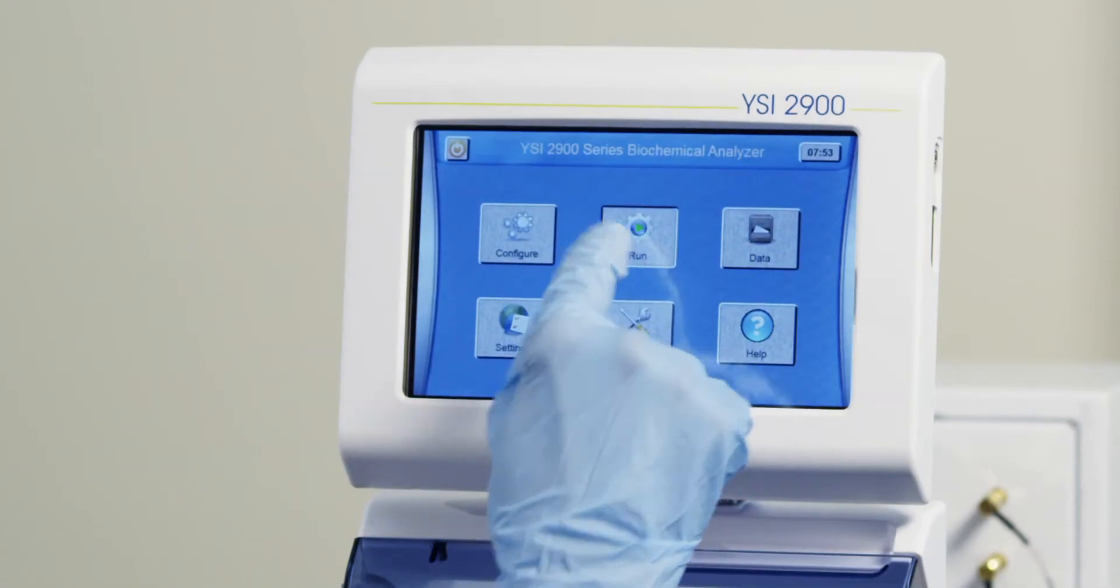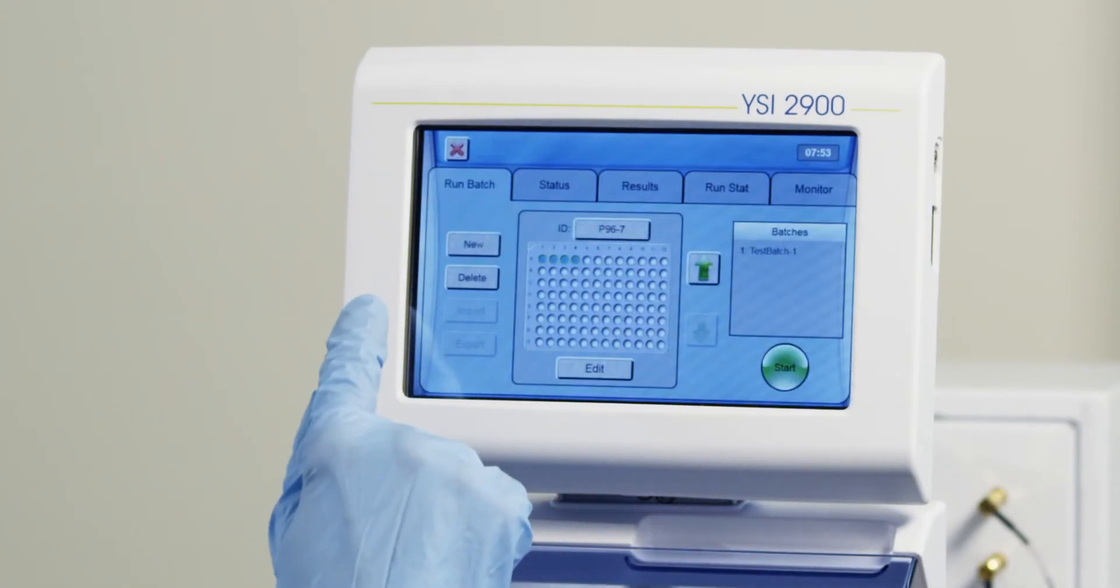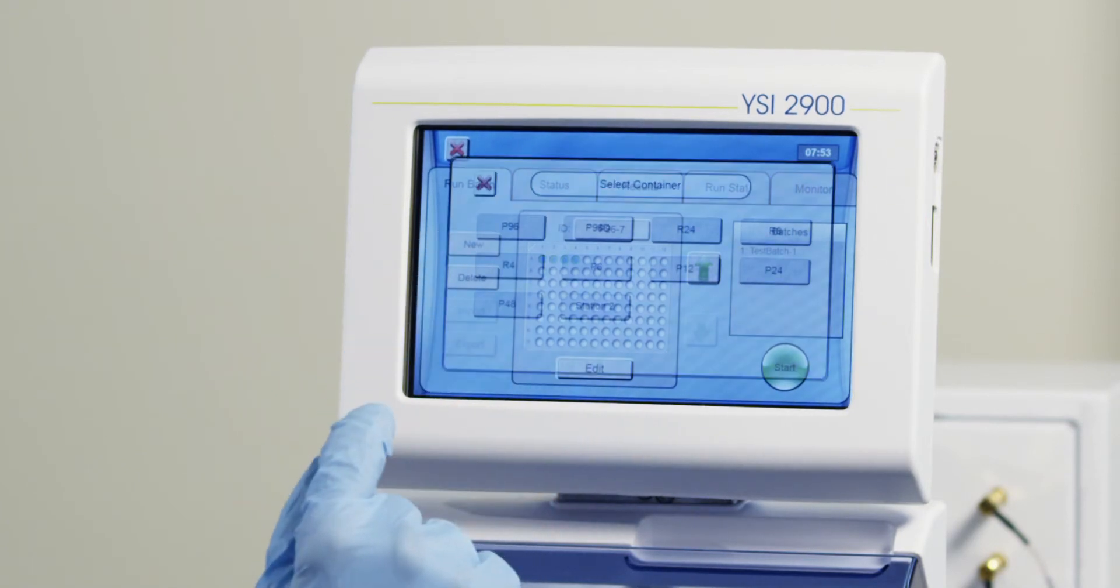From the Run screen, select Run Batch, touch New, and select the container for your run.